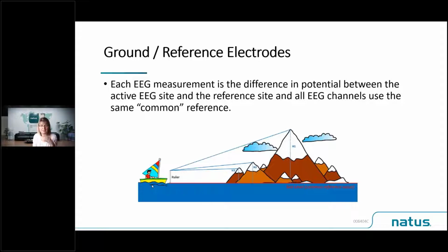So in answer to the question that we get asked a lot, yes, the ground and reference electrode is very important, as is preparation of the skin of the site of ground and reference electrodes. So it's very important to also prepare the skin on those ground and reference electrodes.